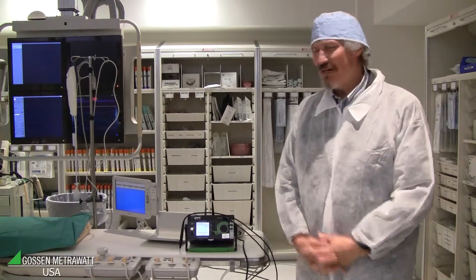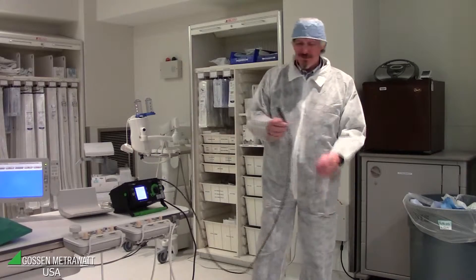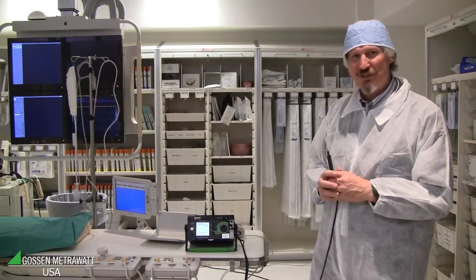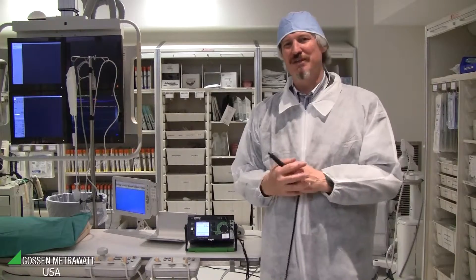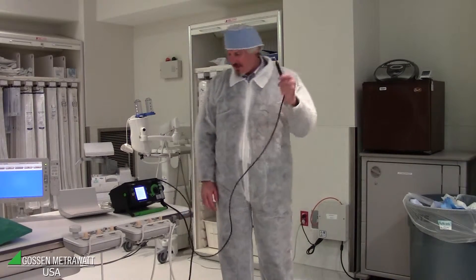In this measurement we do touch current and patient leakage current — we measure the current from each accessible part to ground. For fixed installed devices, we measure the current flowing from the probe to the ground of the system. The ground of the system is connected by a special adapter, which provides power supply for the instrument and connects to system ground.